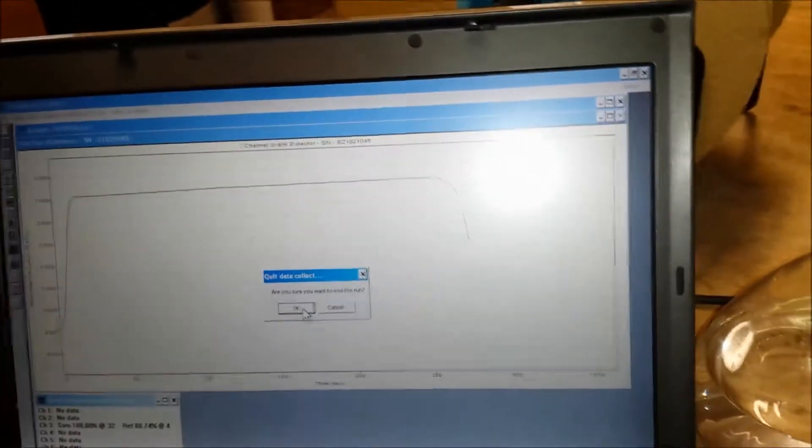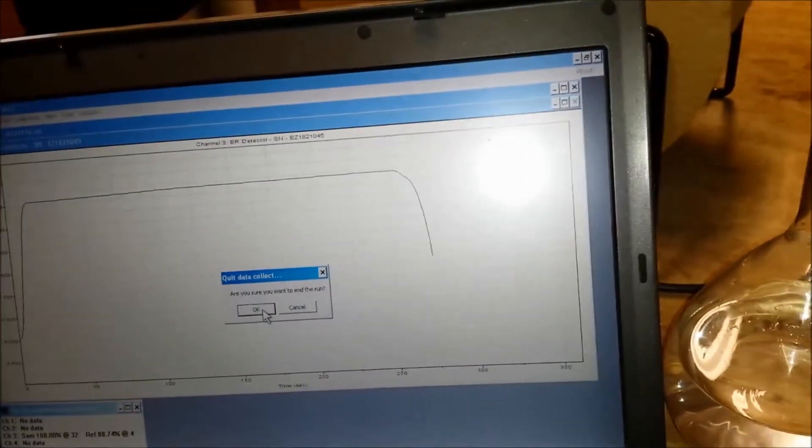And when that happens, you should see that the baseline starts to drop because the bubble has been cleared, and then you need to stop and rewind. You see the baseline dropping there.